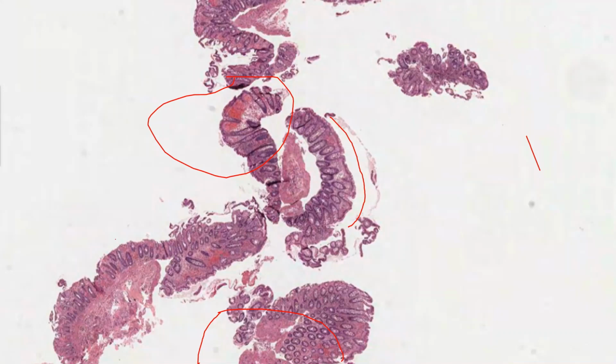While if I look into this surface, the epithelium is not intact and it is falling apart. Can you see? It is falling apart. So you can figure out there is a genuine problem here. This doesn't come under patchy or focal, by the way, but this is just a heterogeneity of the biopsy that's trying to tell you something, right?